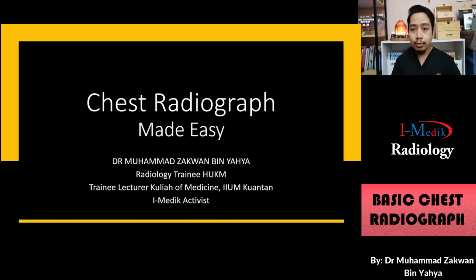Today I will share with you how to approach a chest radiograph. As we know, chest radiograph is one of the commonest imaging requests in any hospital. As a medical officer, a house officer, or even a medical student, we will come across a chest radiograph at least once a week, twice a week, or even every day. So it is important to know how to approach a chest radiograph.